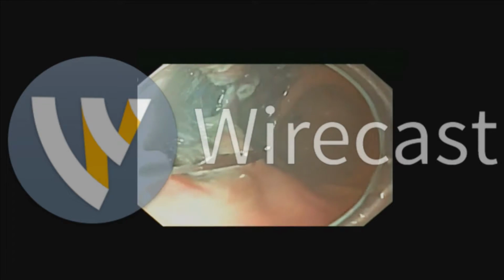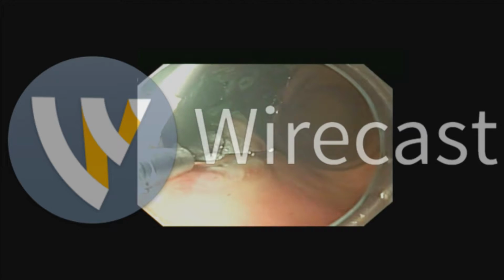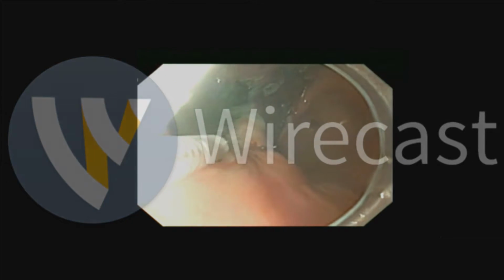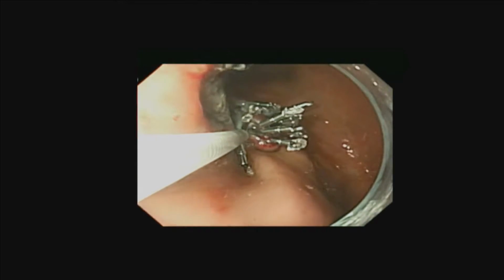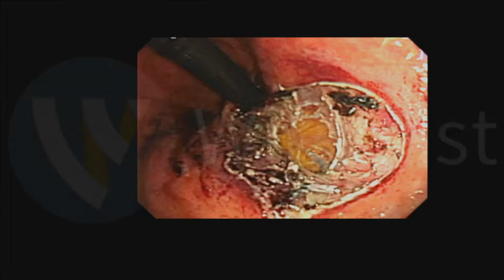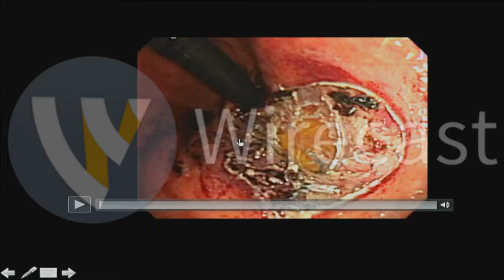Another remaining perforated area like that, and clip closure again like that. Yeah, clip and clip. Almost done. After that I resected everything, and this patient, I'm following up for 10 years. It was okay.